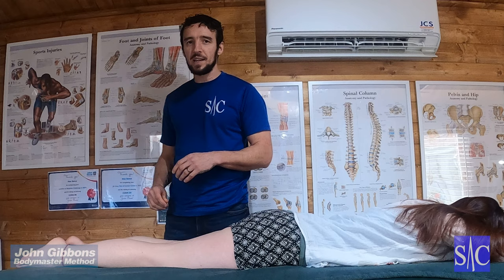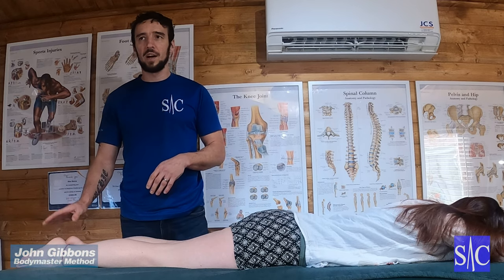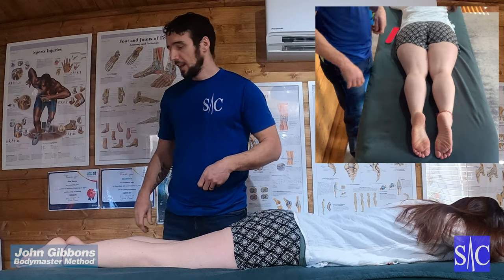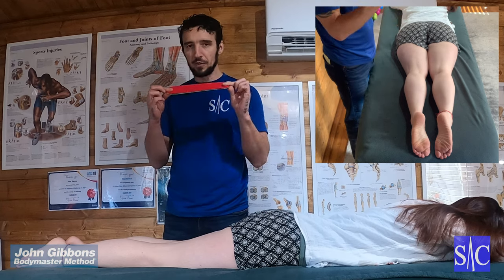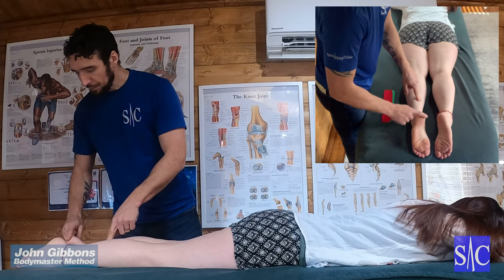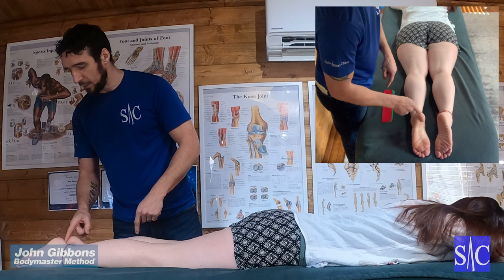This is a taping technique for conditions such as plantar fasciitis, fat pad syndrome, and any pain through the sole of the foot. We're going to need two strips of tape using rock tape, and I'm going to tape the left leg here. The pain is coming through this area and anywhere along the sole of the foot.